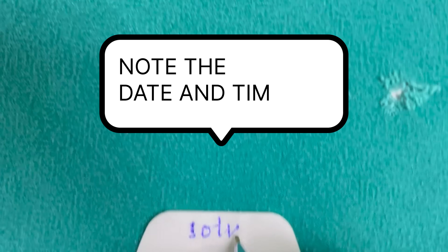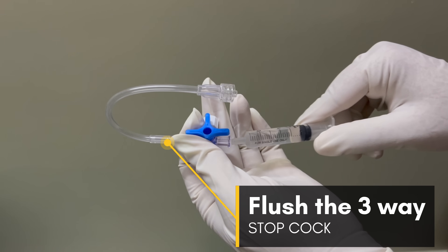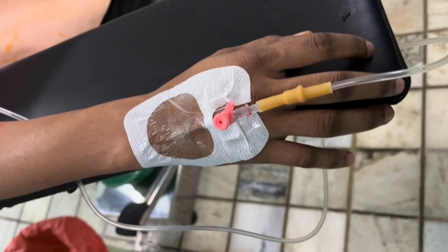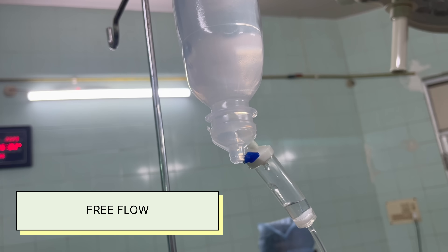Note down the date and time on the adhesive dressing. Secure the cannula slowly without displacing the catheter. Flush the 3-way stopcock with extension using normal saline, attach it to the cannula, and flush the cannula with normal saline. No bump or swelling near the tip, no pain to the patient, and free flow of saline through the vein ensures correct placement of the cannula.